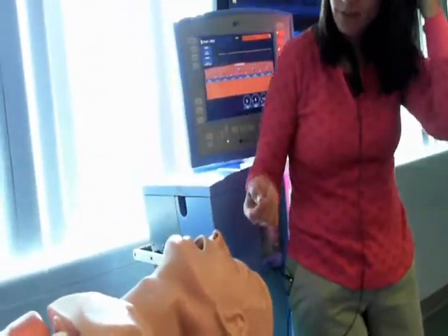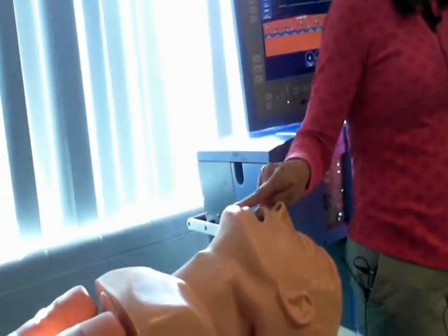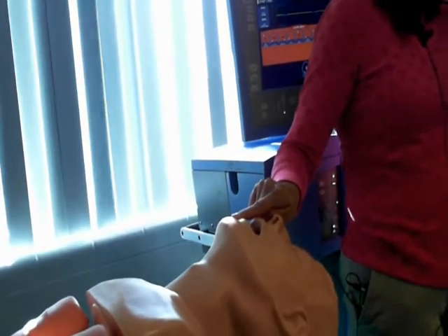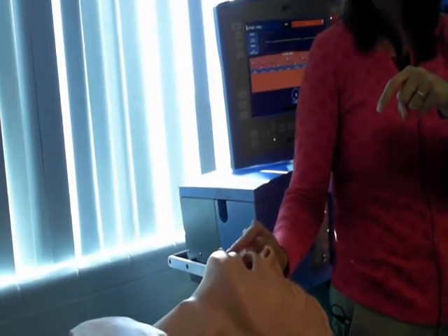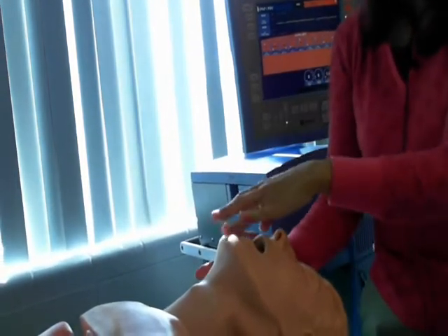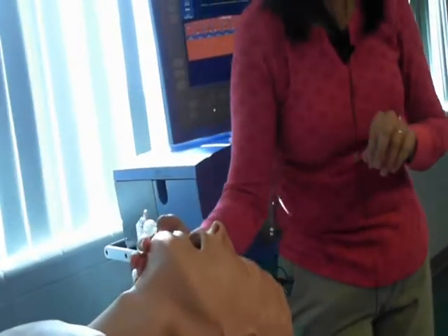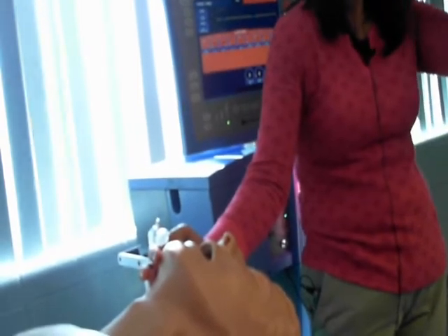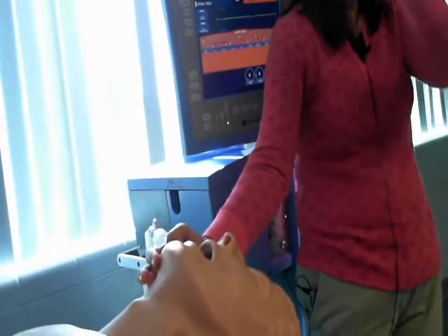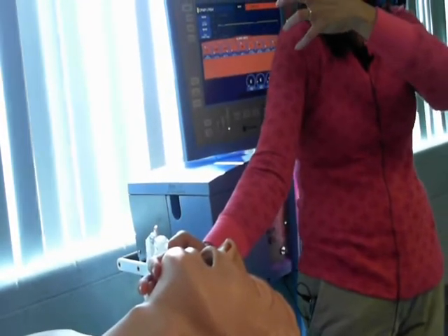Okay, so I'm going to have to put my hands and my face near this patient. And you guys are going to think I'm crazy. But I need to feel for a leak, and I need to listen for a leak. And sometimes leaks are very small. This vent can pick up small leaks.